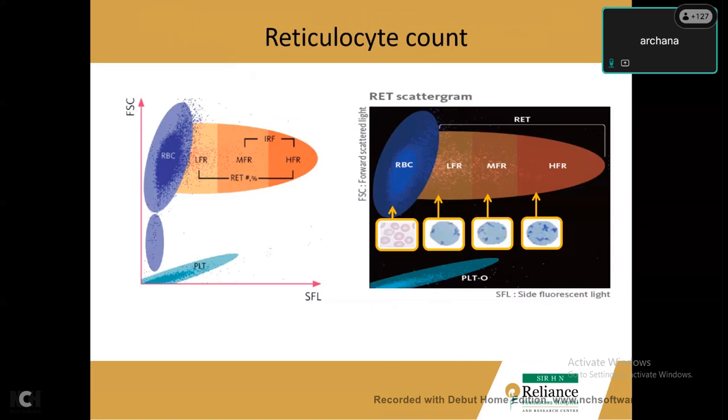If we see a lot of circulating reticulocytes in the peripheral blood, it does indicate that the patient possibly has active erythropoiesis going on in the bone marrow. So how do we analyze this? The channel that processes reticulocytes dyes the sample with fluorochrome dyes, something called polymethine. These fluorochrome dyes are specific to stain RNA. So it stains all the RNA or the reticulated cells in the blood.